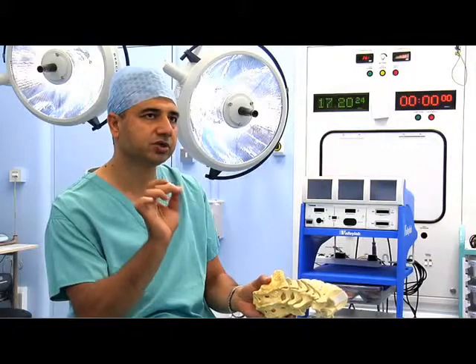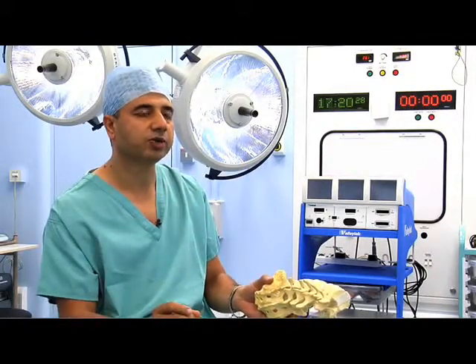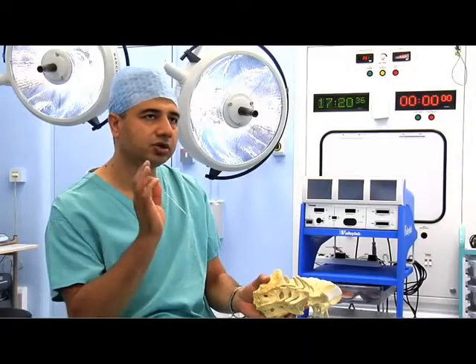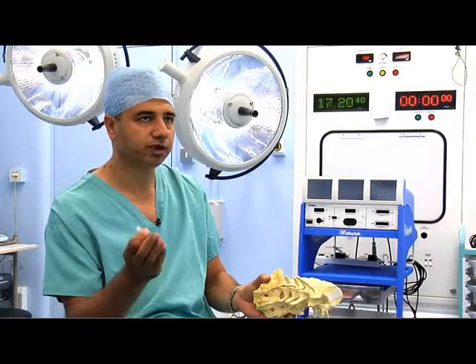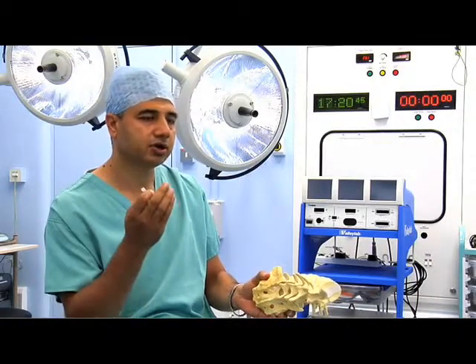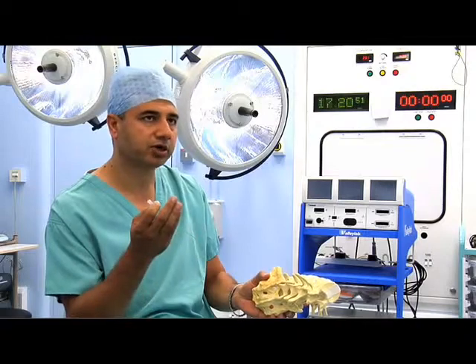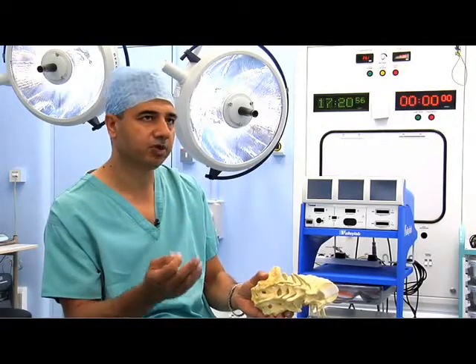I place the needle, so it's only a needle scratch incision, so it does not involve putting any stitch in. And because I don't enter into the spinal canal, I go through the foramina, so I don't disturb any patient's muscles, which can cause a lot of post-operative pain and analgesia. Second, I don't disturb the normal anatomy of the bones. I don't enter into the spinal canal, so the chances of developing any post-operative blood clot or any injury to the neural structure is really very minimal.